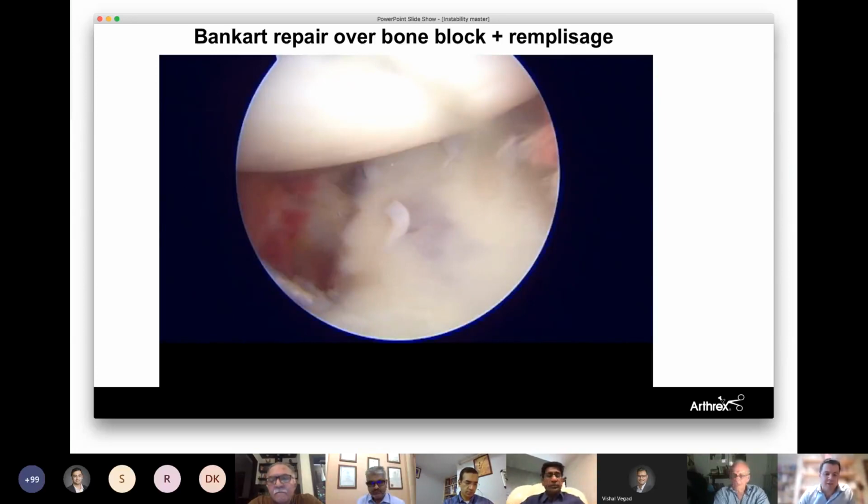Yeah, and also the one thing to comment here is that lately I have been experimenting a little bit with buttons and the button fixation and sutures. But the problem with that is first that they are quite weak fixation with buttons and the suture. And then you should insert your glenoid anchors before you pass the sutures from the buttons. Otherwise, you can risk that you will drill into the suture from the buttons. But the nice thing with the tape cerclage is that it's really powerful, and if you use 1.8 knotless anchor, then you don't have to be afraid to drill. Now, you don't have to be afraid either when you're tensioning that you somehow rupture the sutures from the block, you know.